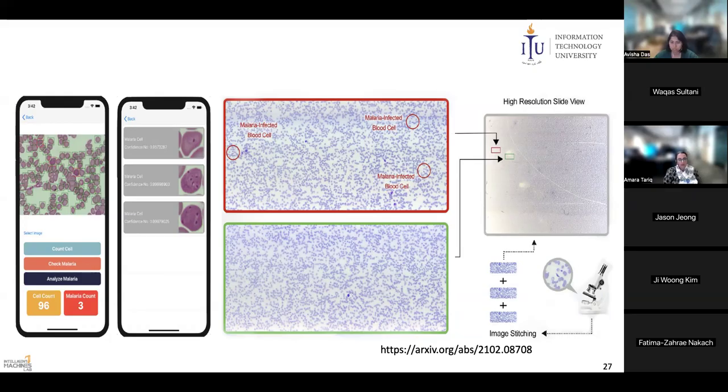Usually they do the practice manually if they don't have a scanner, which is very costly, so they have no other way to train the doctors. They can also use this during the exams, to test the doctors on finding the specific cells, naming them and classifying them.